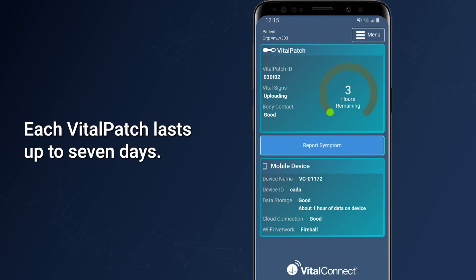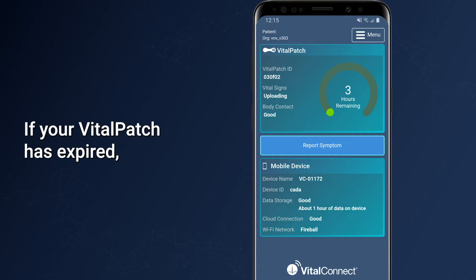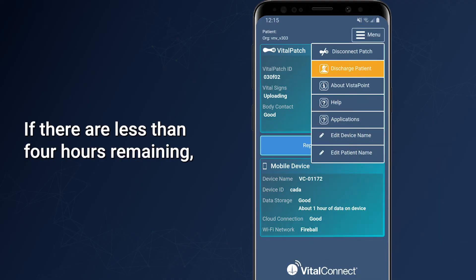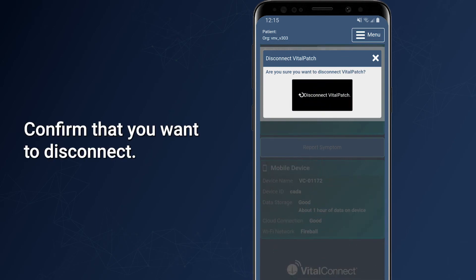Each Vital Patch lasts up to seven days. When the Vital Patch expires or has less than four hours remaining, you should replace it with a new Vital Patch. If your Vital Patch has expired, follow the instructions on the screen. If there are less than four hours remaining, tap the Menu button, then tap Disconnect Patch, and confirm that you want to disconnect.